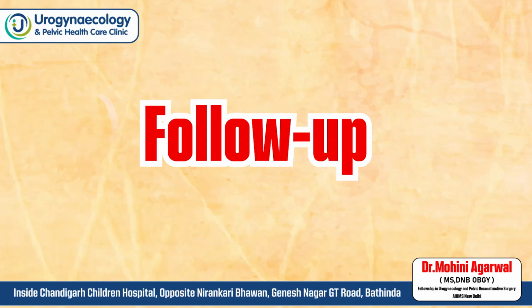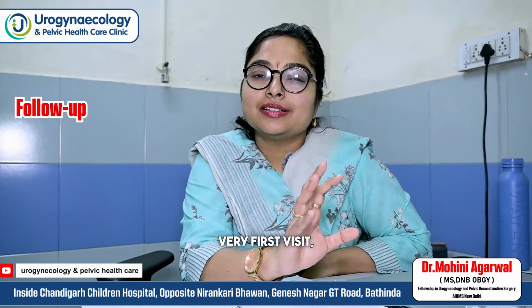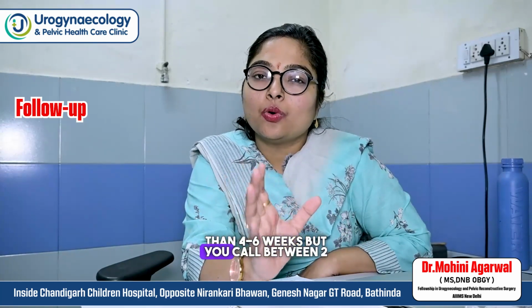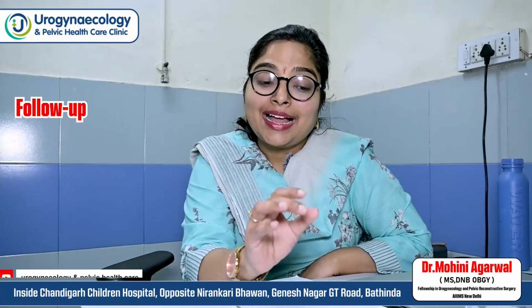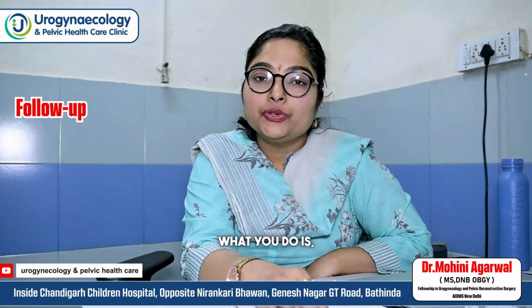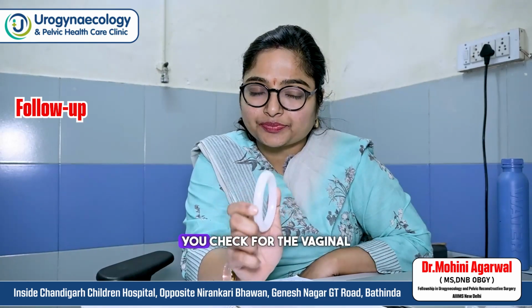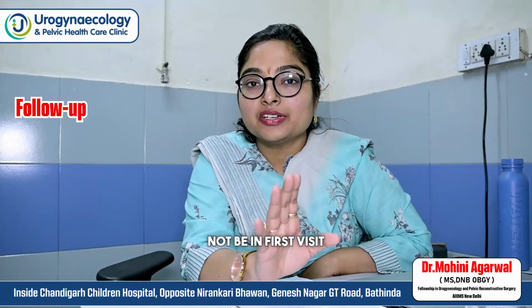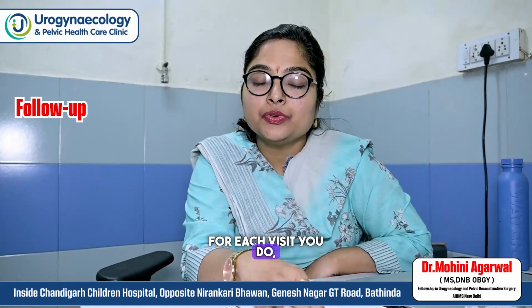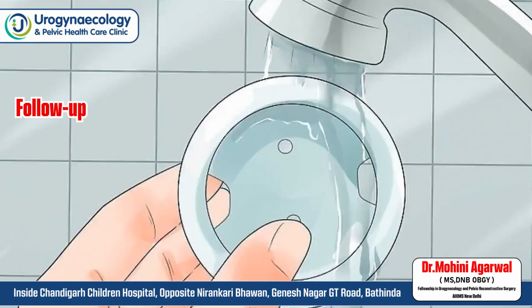Then follow-up. Once you have inserted the pessary, how do you ask the patient to follow up? Very first visit, it's said no longer than 4 to 6 weeks, but you call the patient within 2 weeks of insertion. At each visit, you remove the pessary, you check the pessary for any cracks, its elasticity, you check the vaginal wall for any pressure, symptoms, ulcer, sores. Then you wash the pessary and replace it. This is done in each visit.